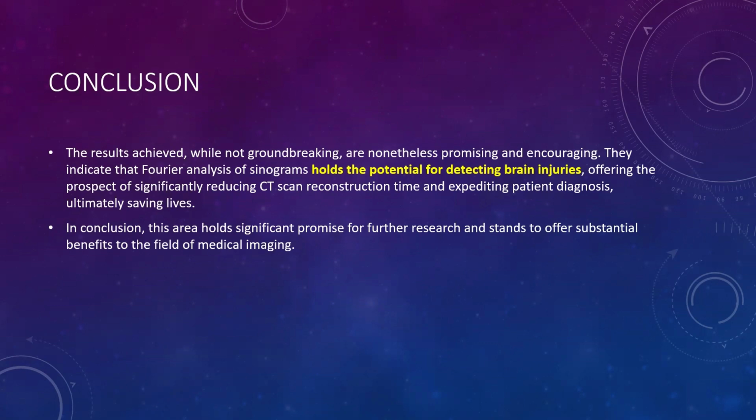And since we are using only Fourier transforms, this will help the medical field very much, because the computation and detection of the brain injury doesn't take long. It takes less than 5-10 minutes, but the methods we are using now take more than half an hour. So this would be a very good thing in saving people's lives.